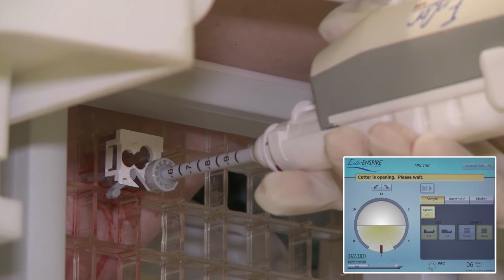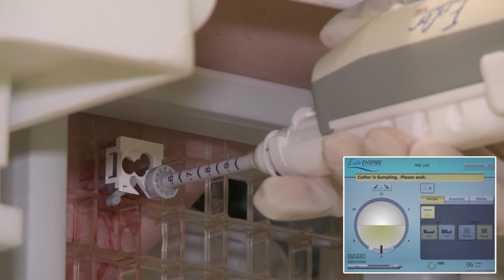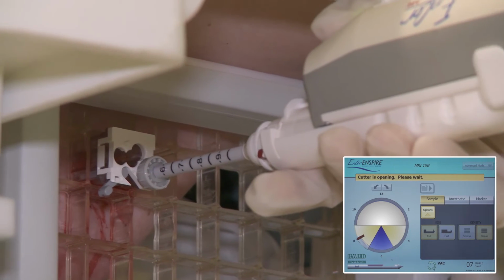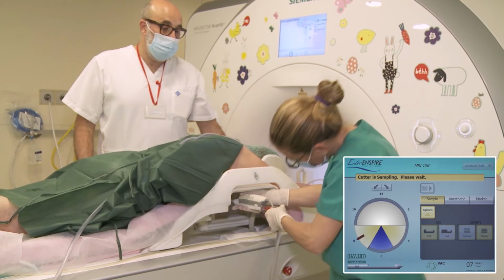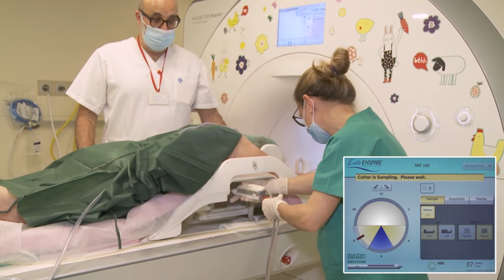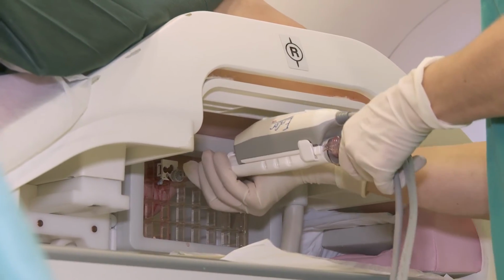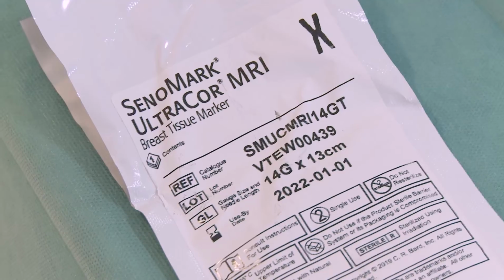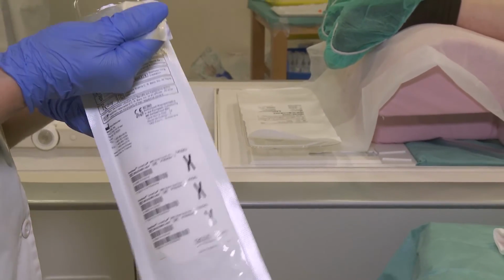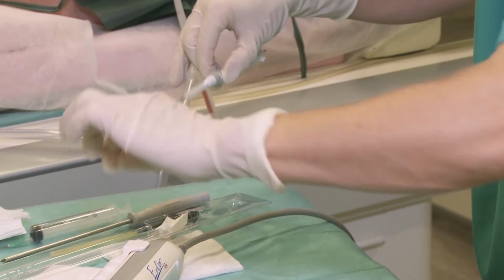Half bottom pattern nipple orientation is set up in the EnCor touch screen. Sampling is completed. Senomark ultra-core breast tissue marker is prepared. The tissue marker will help to locate the biopsied area afterwards when needed.